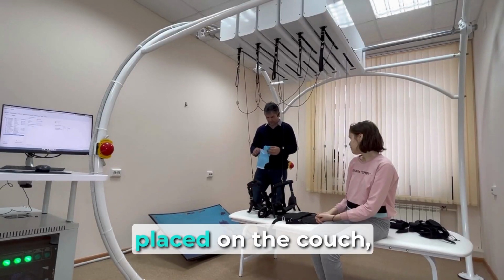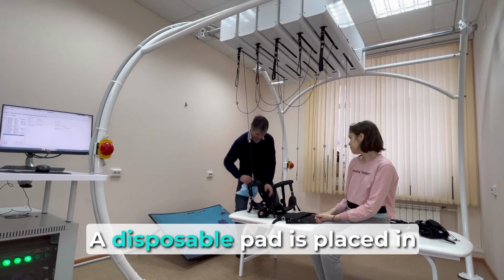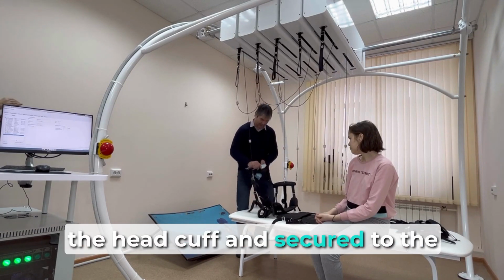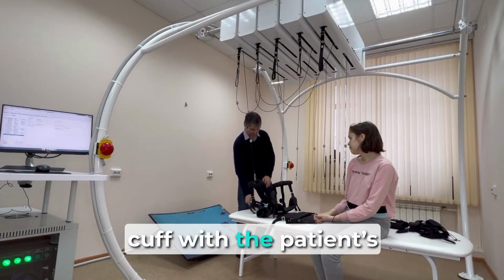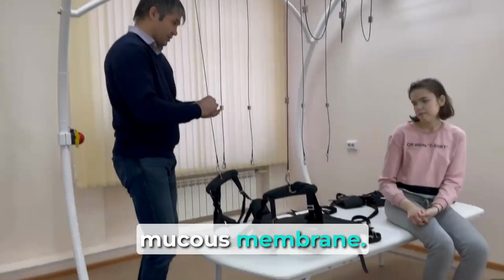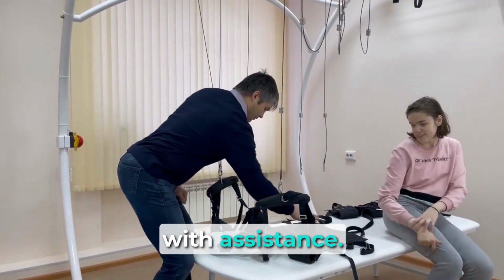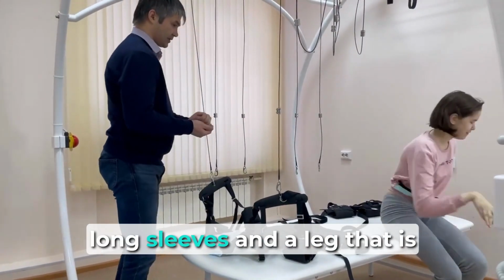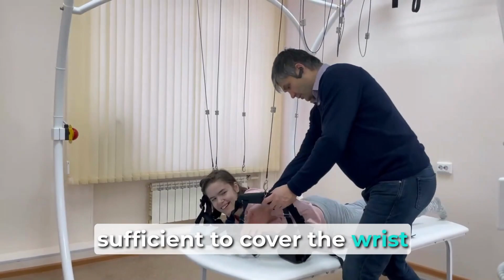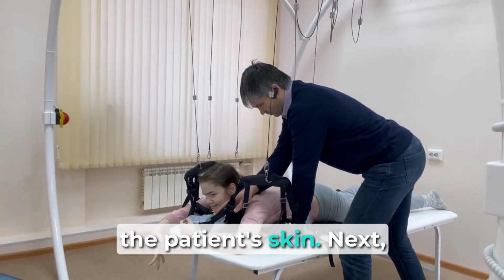Before the patient is placed on the couch, a cuff of the appropriate size is placed. A disposable pad is placed in the head cuff and secured to the cuff using adhesive inserts in order to prevent contact of the cuff with the patient's mucous membrane. The patient is placed on the couch independently or with assistance. The patient should be dressed in comfortable, non-restrictive clothing with long sleeves and legs sufficient to cover the wrists and ankles to prevent the cuff from coming into contact with the patient's skin.